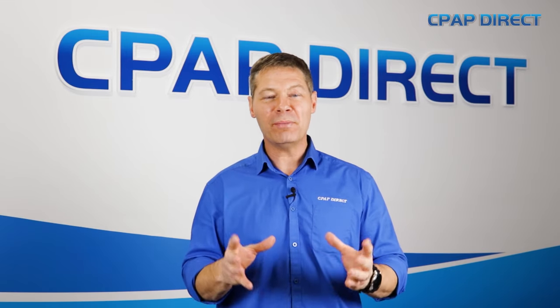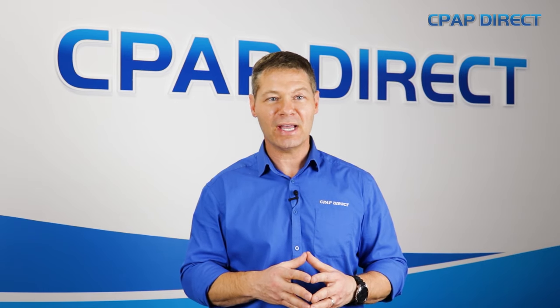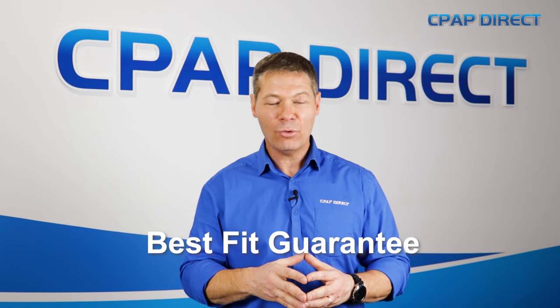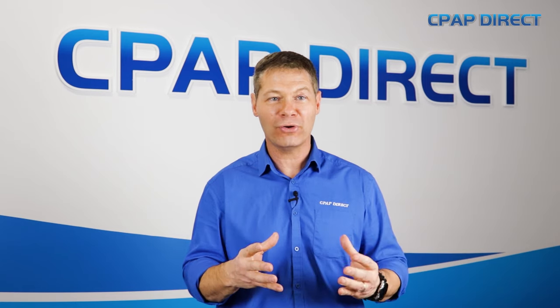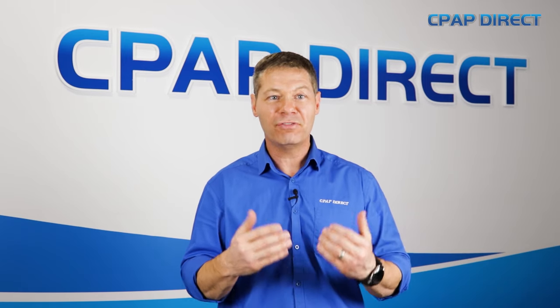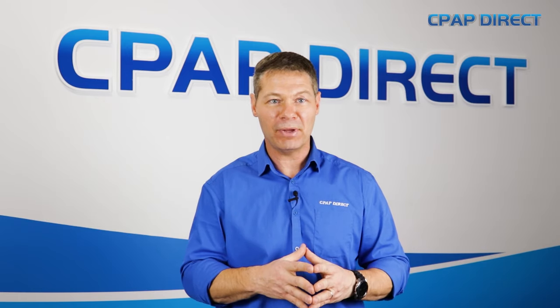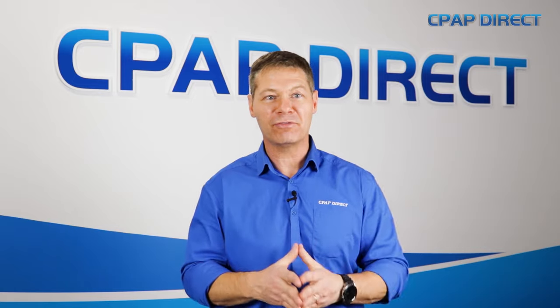The best way to find the right mask for your face is to come and see one of the crew at CPAP Direct and have a proper mask fit. We have a best fit guarantee, which means our clinicians — who are super experienced in the CPAP world — will find the right mask for your face, the right size, adjust it for you, and make sure that you're happy. In fact, they even guarantee it: if it's not right, they will swap it out for free.